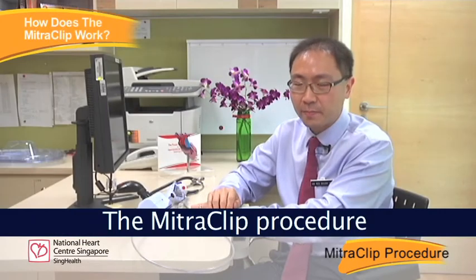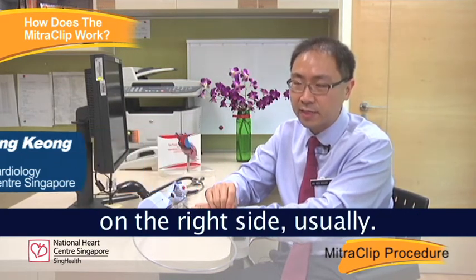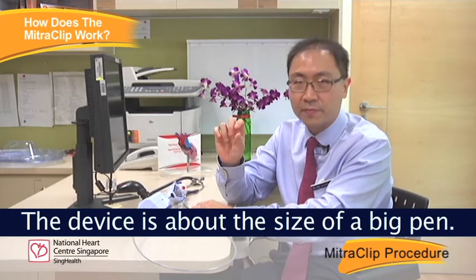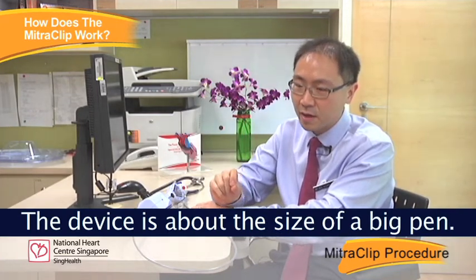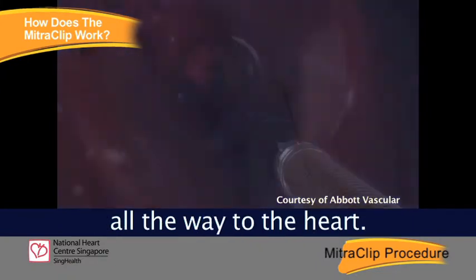The mitral clip is minimally invasive. We do the procedure via a small cut in the leg vein on the right side usually. The device is about the size of a big pen, and we put this device all the way to the heart.